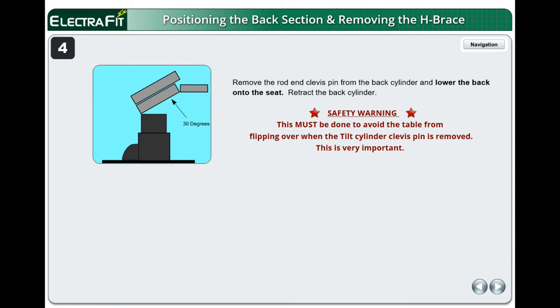Remove the rod end clevis pin from the back cylinder and lower the back onto the seat. Retract the back cylinder. Safety warning: this must be done to avoid the table from flipping over when the tilt cylinder clevis pin is removed. This is very important. Remove the clevis pins from the tilt cylinder and retract the cylinder. Keep these pins — they may be reused.